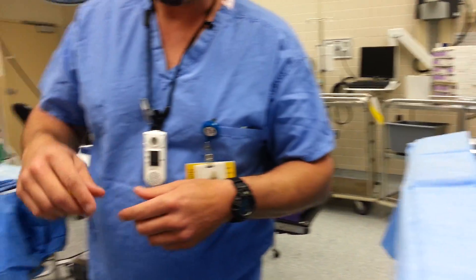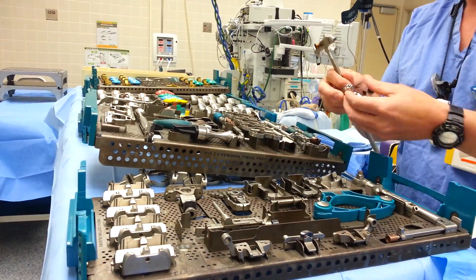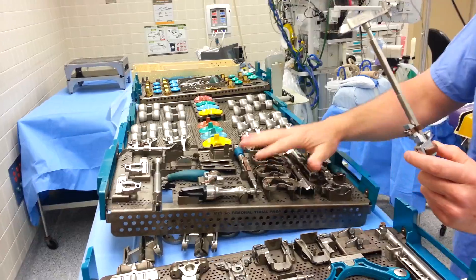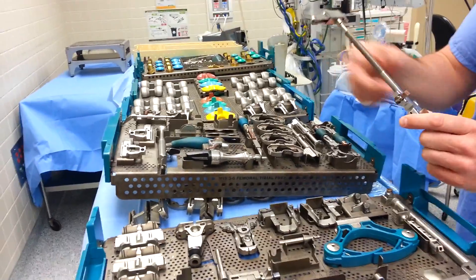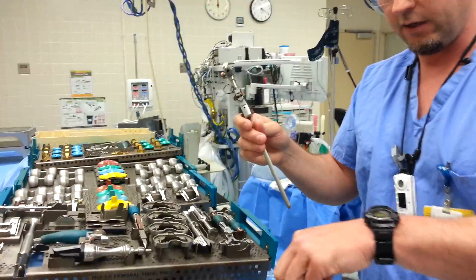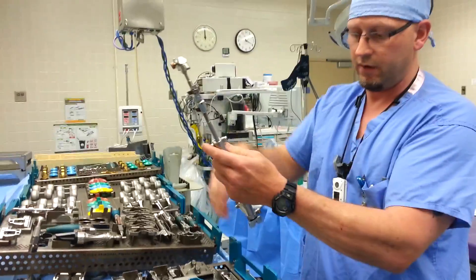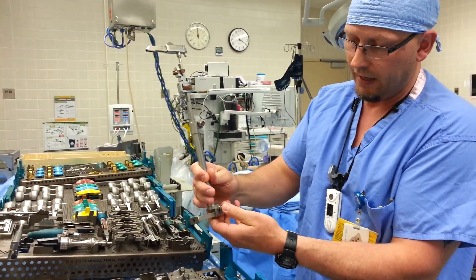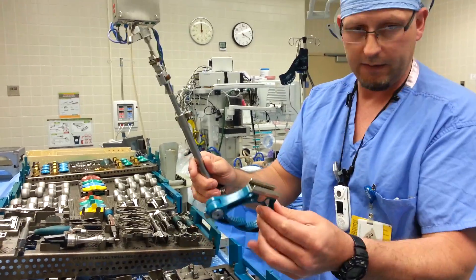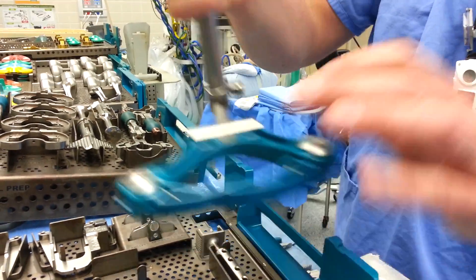Now we're going to put together the tibial cutting block. You need a few things: grab this long rod, grab the zero degree slope because we use zero degree slope here, and slide this bracket together. Anything on the triathlon system that's gold is a button or it moves. Push in the gold button and slide it up to somewhere in the middle. Then you'll slide these two pieces together, push in another gold button, and let it slide down to the middle. Push in the ankle clamp adapter with your palm, grab the ankle clamp, always have the notch side up, put it in the middle and let go of the button — your clamp is together.